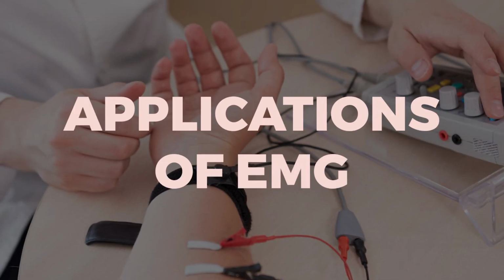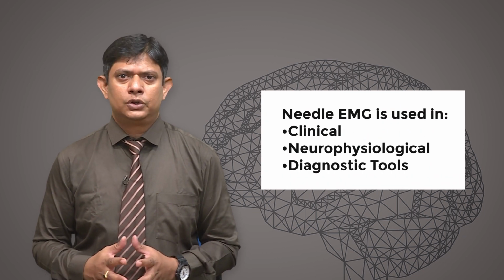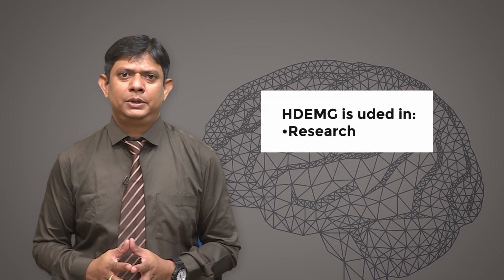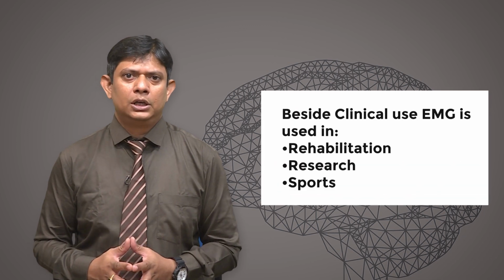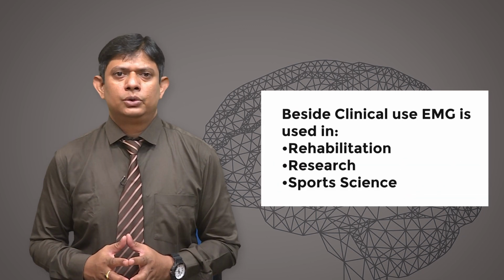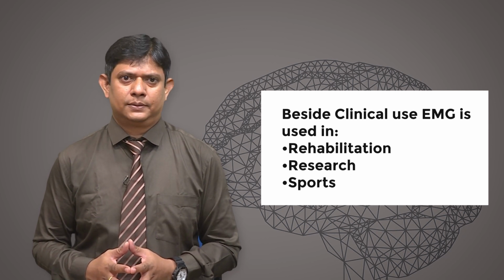Now, the applications of EMG: EMG can be used in several fields. As mentioned previously, needle EMG is used as a clinical, neurophysiological and diagnostic tool. HDEMG has been more research focused. Besides clinical use, EMG is used in rehabilitation, research and sports science.